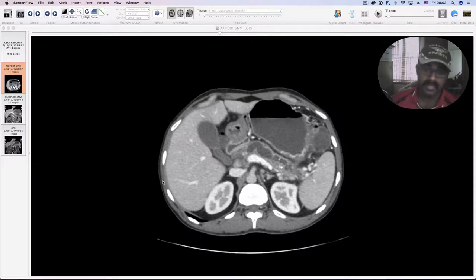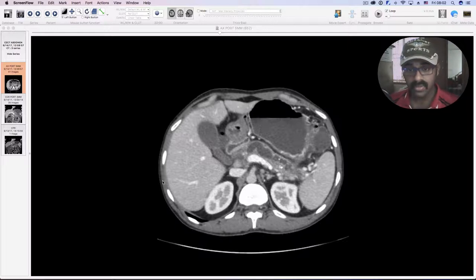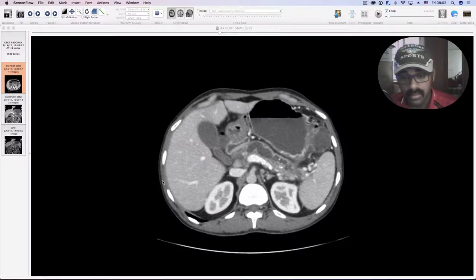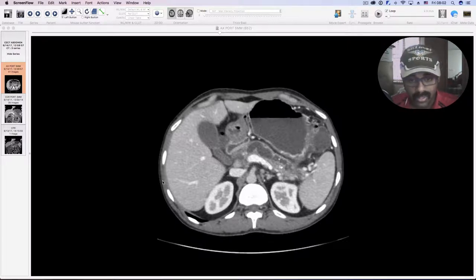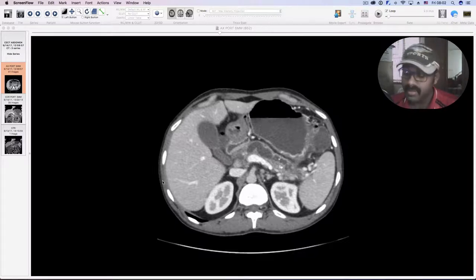We did a contrast CT of the abdomen using negative contrast for oral administration. We used mannitol in a 1:3 dilution, approximately two liters of oral contrast administered over a period of one and a half to two hours, allowing for slow distension of the bowel loops, following which we gave IV iodinated contrast and did the imaging in portovenous phase.